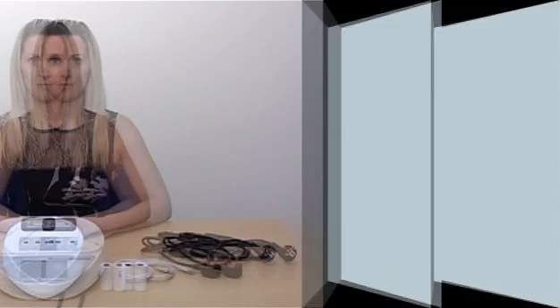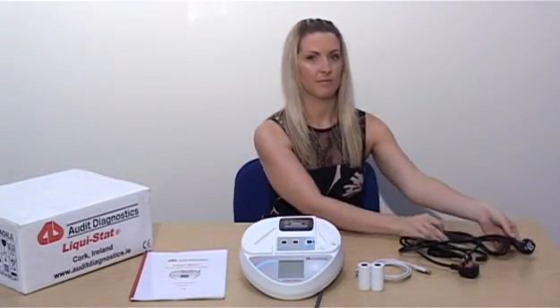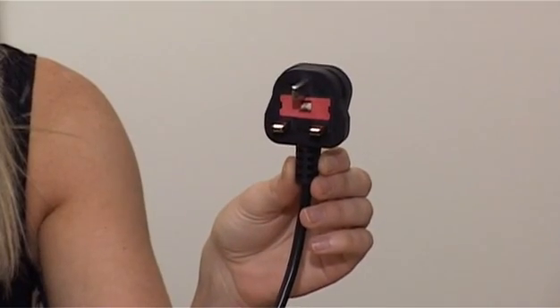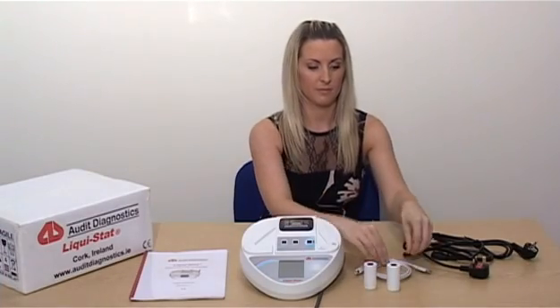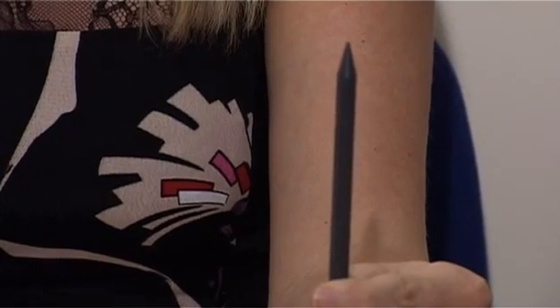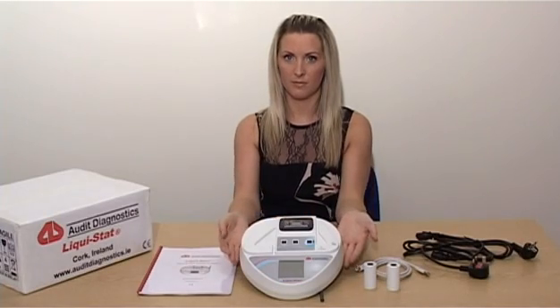Liquistat Overview. The Liquistat analyzer pack will consist of two power cables — one European and one UK-Ireland compatible — two rolls of printer paper, one USB cable, one touchscreen pen, one user manual, and the Liquistat analyzer.